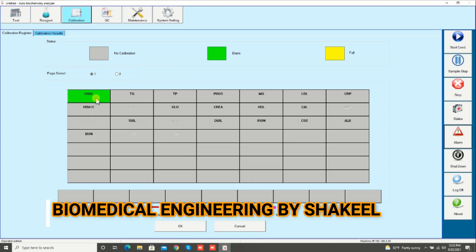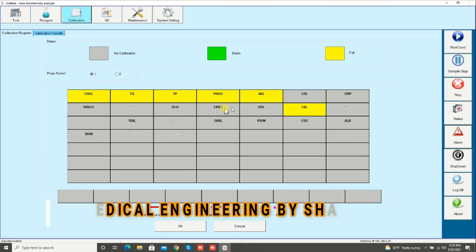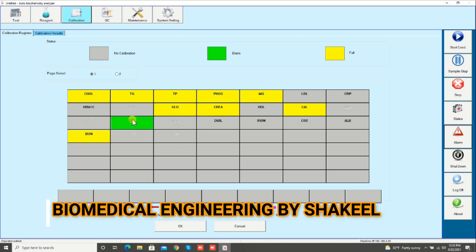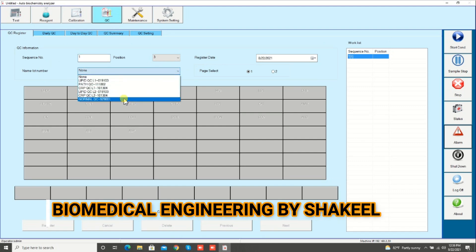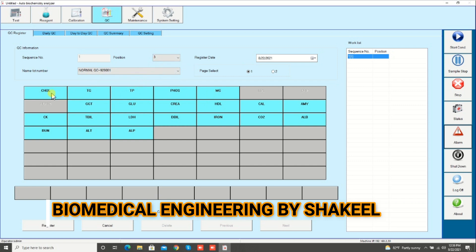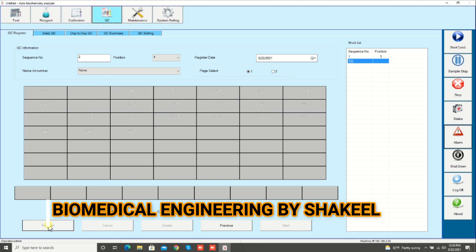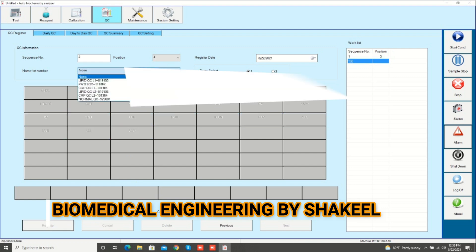Now we will see how to do the calibration and QC. Click on calibration and then click on the parameters. Be sure to always double-click on the analyzer, because one click makes it green which means blank, while double-click means you want to do the full calibration. Select all the parameters then click OK. Same as, if you want to run quality control, click on QC, select the lot or name — suppose normal control — and assign the position. If you do not select specific tests it will run all QC. All blue color means it is ready to run, and at the end click register.